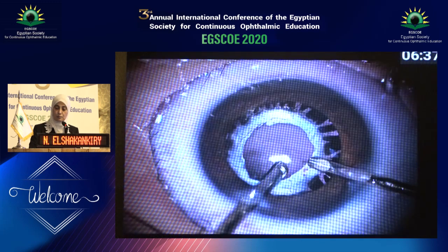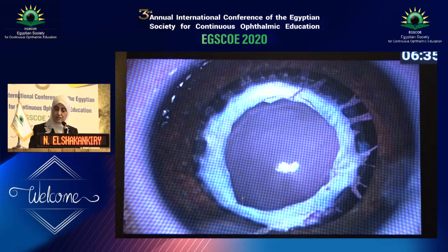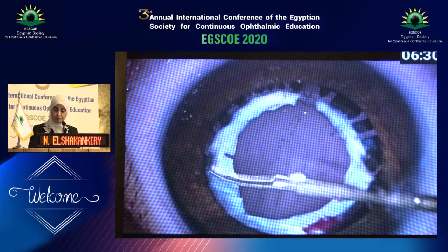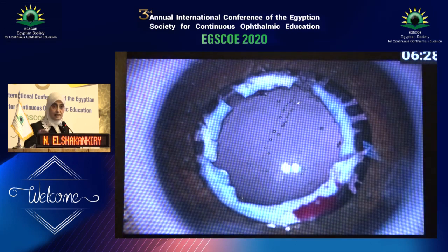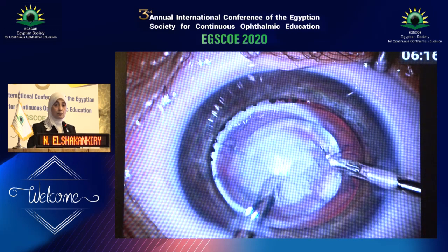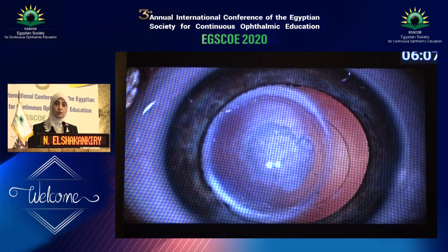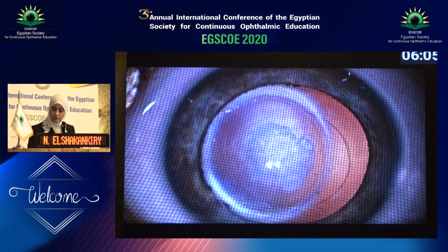And after eating up the membrane, again, we cannot leave this capsular ring like that. We cut it in all quadrants by micro scissors, but take care never to go towards the periphery. Otherwise, it will retract, and you're going to lose this capsular support, preventing you from secondary IOL implantation in the future. But on the other hand, sometimes there is a very minimal ciliary processes prominence like that, and the membrane is totally fibrotic without vascularization.